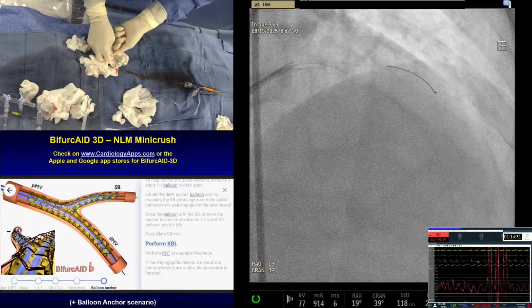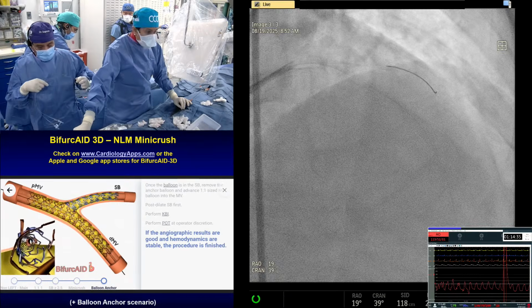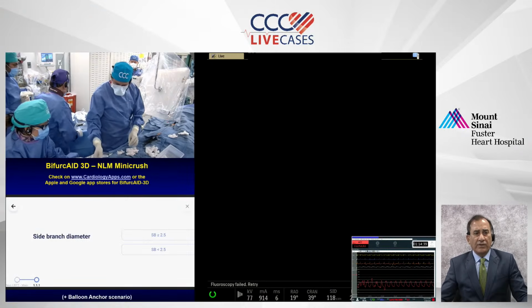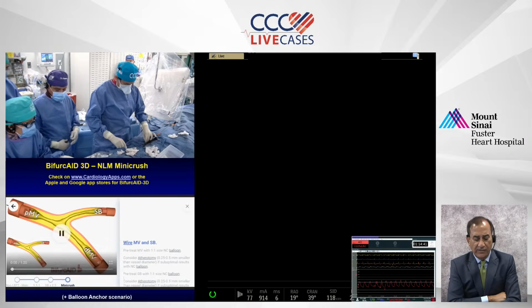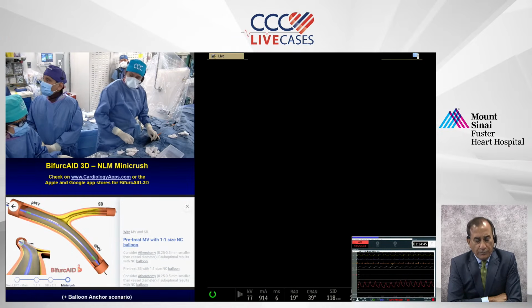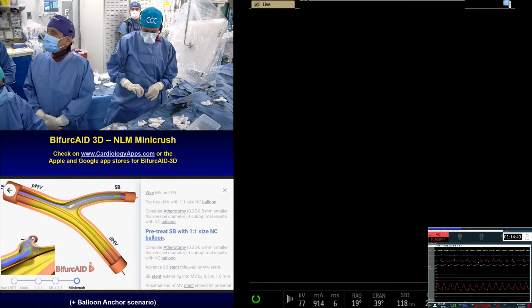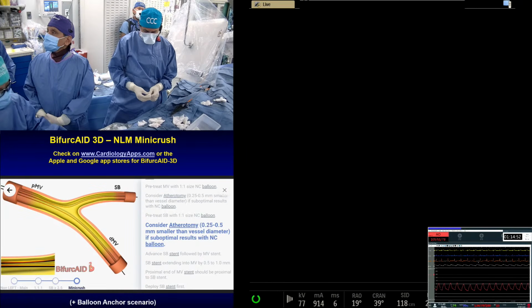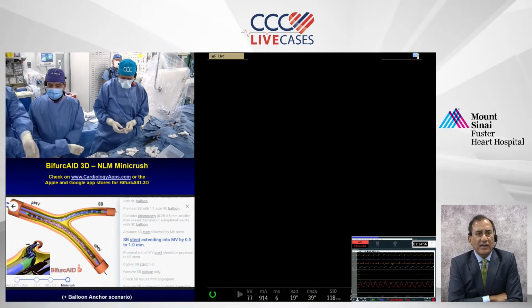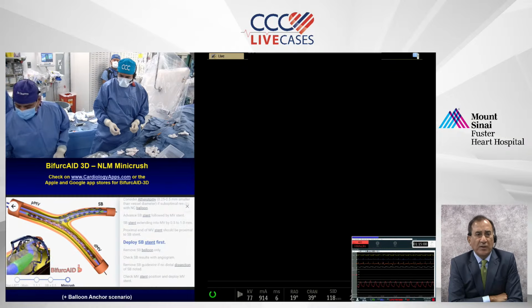Jha back into the discussion, because he raises a good point. I think it may have been because of how we advertised this case. Could we have used the DCB for the diagonal? No, I think we went through that. That was the plan. Remember, that was the plan. We talked about the dissections and all that, and I think in conclusion he's thinking back, maybe sipping the coffee and thinking, look, could we have done it? Yeah, maybe.